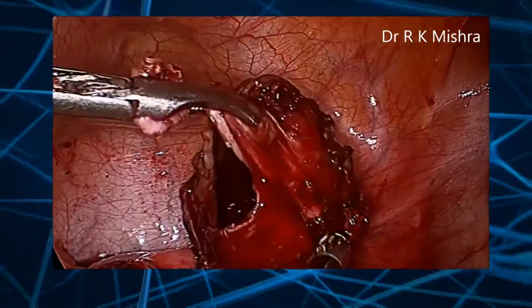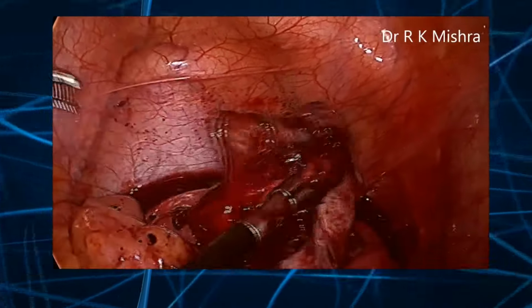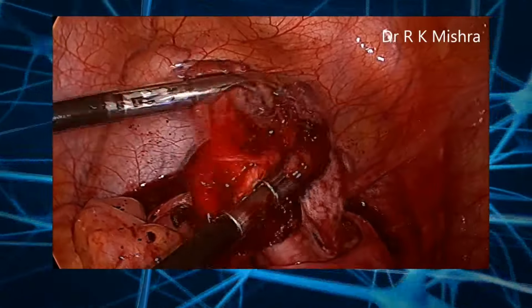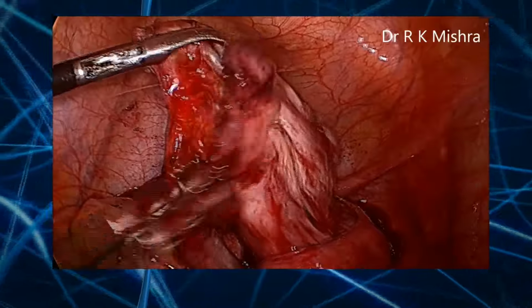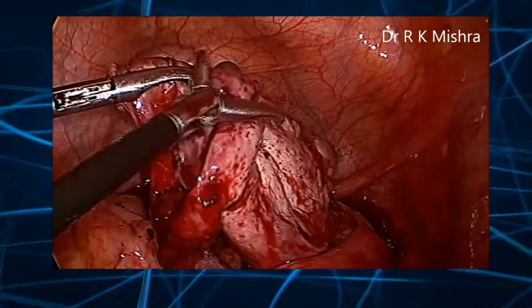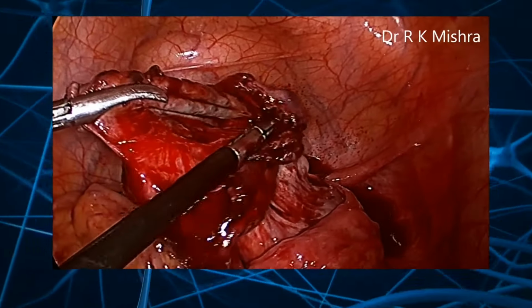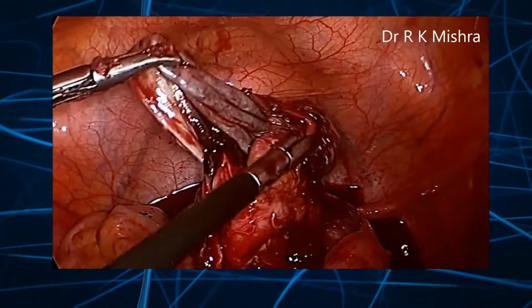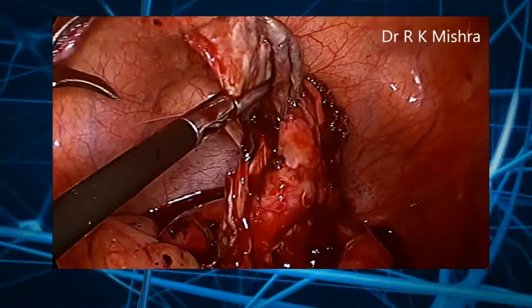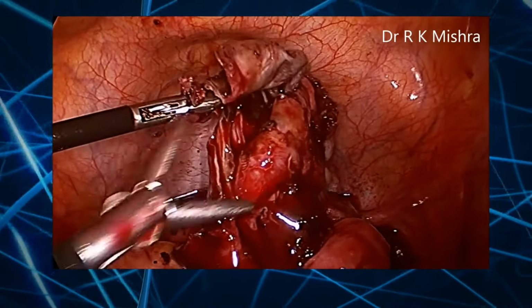And then this is 2 Maryland doing the ovarian cystectomy. Maryland is slipping repeatedly. If it is repeatedly slipping, you bring the claw forceps, 1 claw forceps and 1 Maryland is good. This is Maryland is slipping repeatedly, then during dissection you have to be careful.